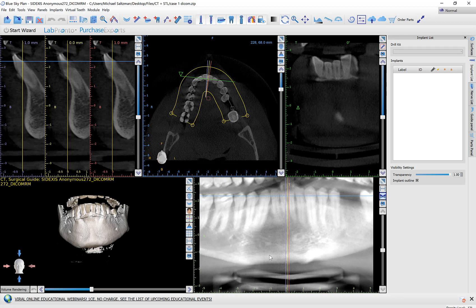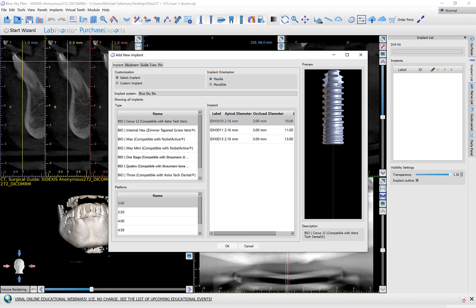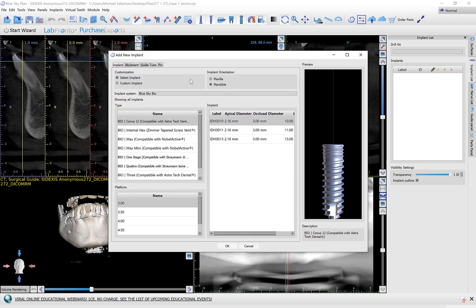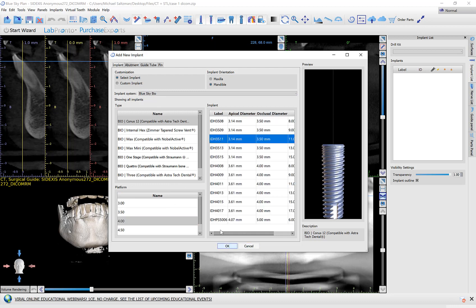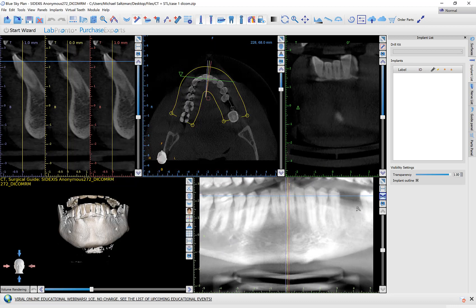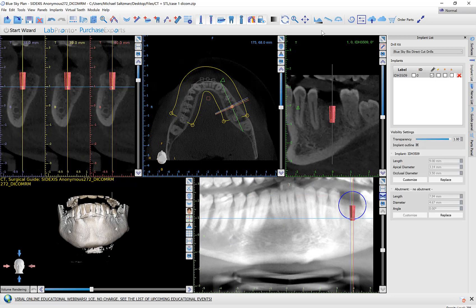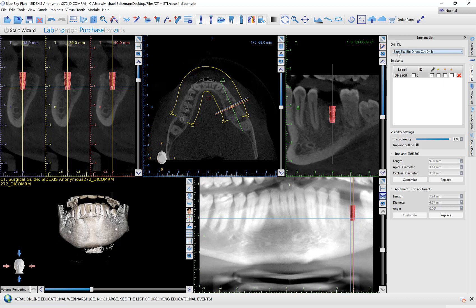Generally, the recommended approach is to go ahead and click on the relevant implant, select it, and place it. Now once you do so, the drill kit options change. The drill kit options are only going to show you drill kits that are compatible with the implant that you've already placed.